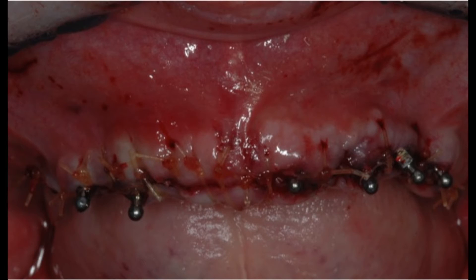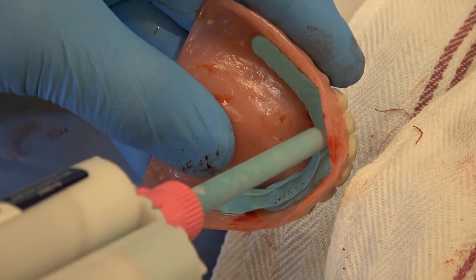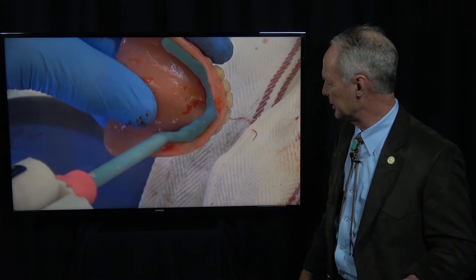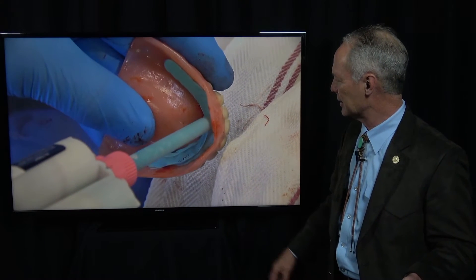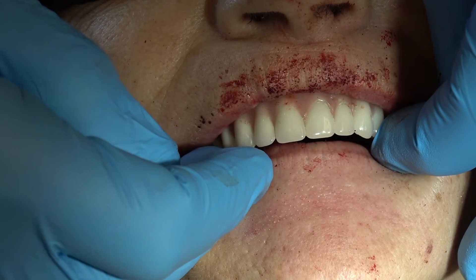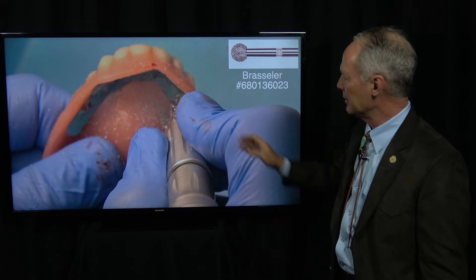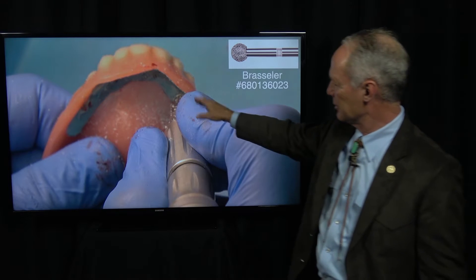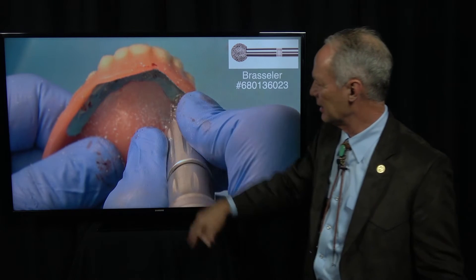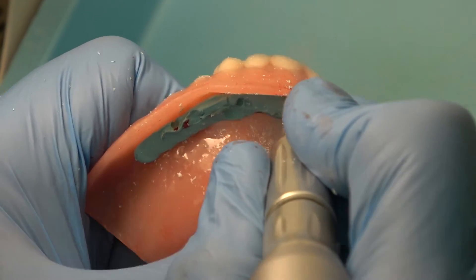We've placed small diameter implants, so I'm going to squirt this super-fast-setting blue mousse polyvinyl siloxane in the denture so I can mark the position of the small diameter implants. Now, before you put this in place, be sure you put some neosporin ointment on the surgical site so this blue mousse doesn't stick to the suture.